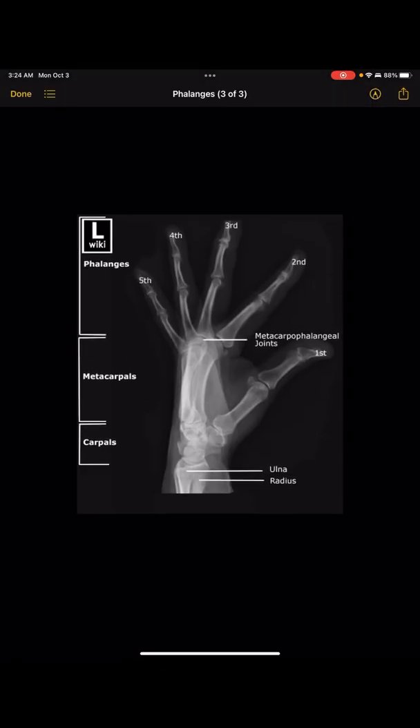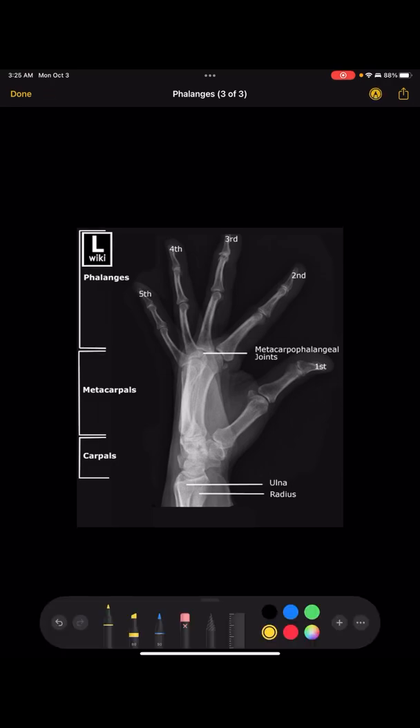Finally, for the lateral — some people do a regular straight lateral where you don't separate the fingers, but the preferred method is a fan lateral, where the hand is totally on its side and you separate all the fingers so you can see a good view of each one. Lateral hand X-rays are taken to see if there are any foreign bodies, and also to see how displaced a metacarpal fracture is.